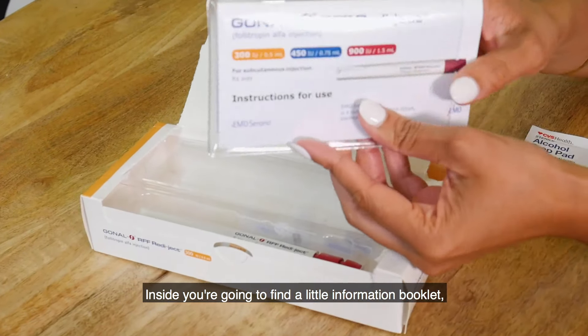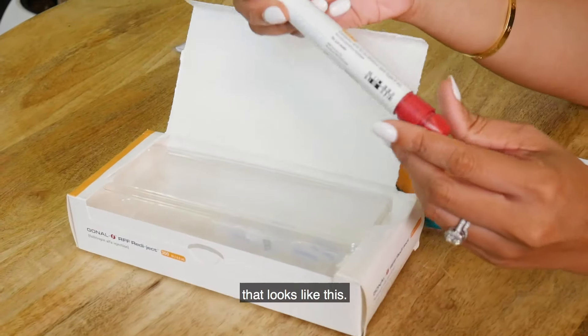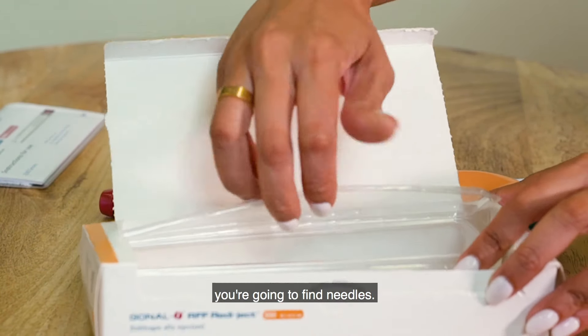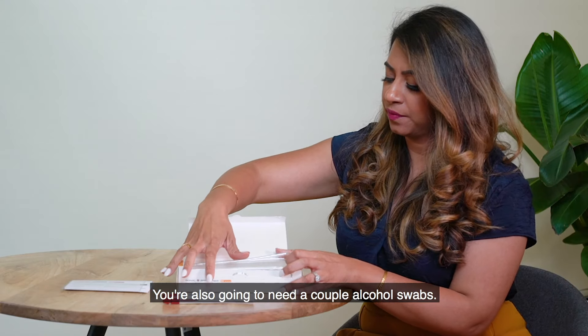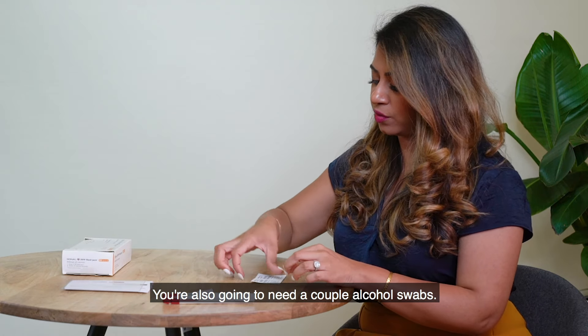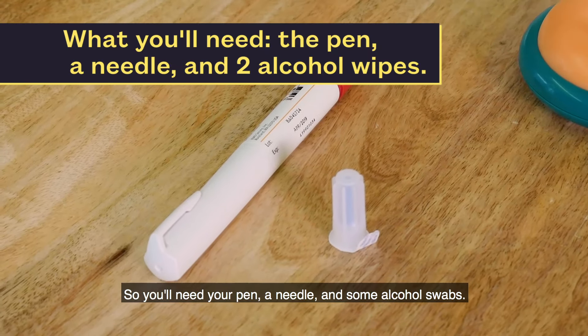Inside you're going to find a little information booklet, and then you're also going to find your pen that looks like this, and inside the plastic casing here you're going to find needles. Take one of the needles out. You're also going to need a couple of alcohol swabs — so you'll need your pen, a needle, and some alcohol swabs.